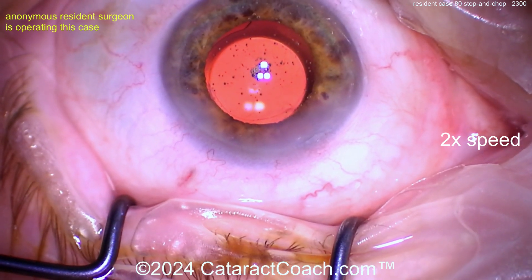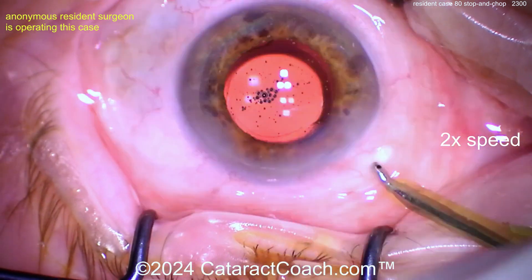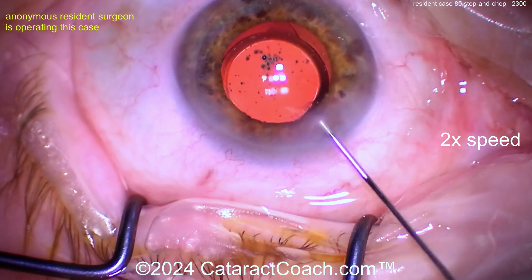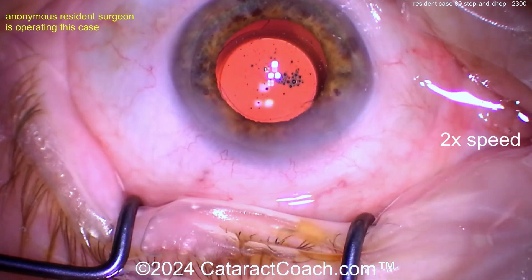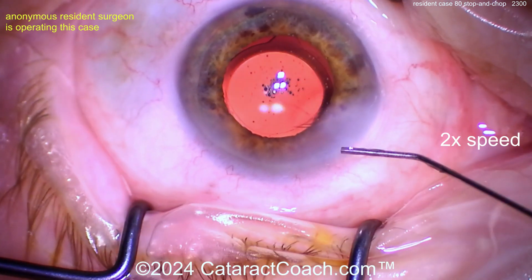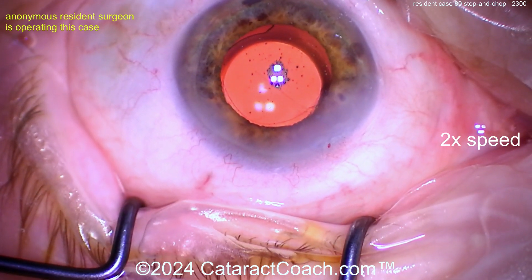Make sure it's absolutely watertight — last thing you want is a leak on post-op day one. The I/A probe went back in the eye again — maybe there was some viscoelastic. A little more hydration, looking pretty good. Patient is under topical anesthesia — told the patient to look at the light. Lens is centered. How's the incision looking? Just put a suture already — why suffer? The patient deserves a suture, it's not that big of a deal.